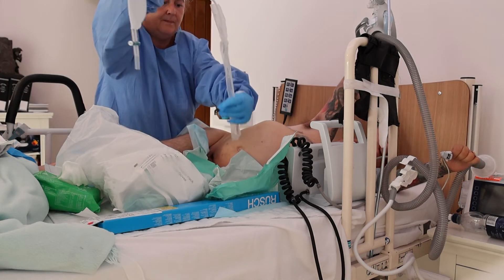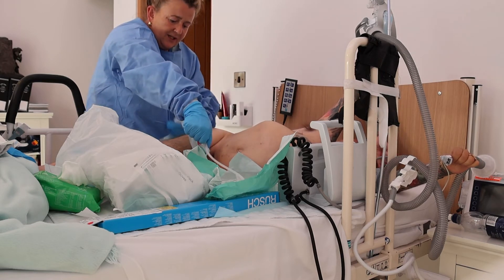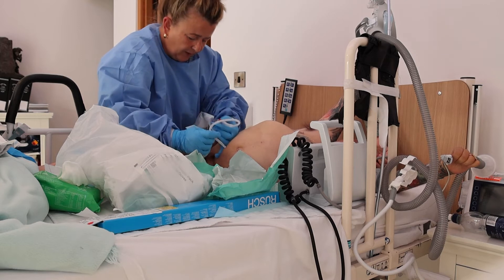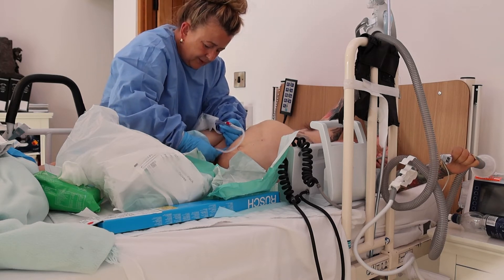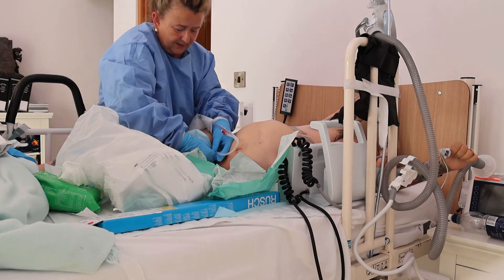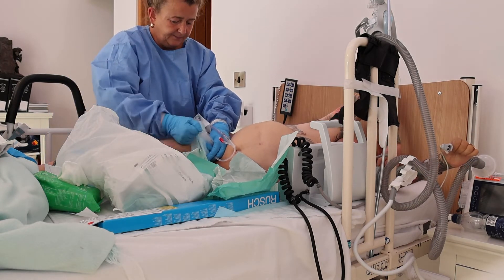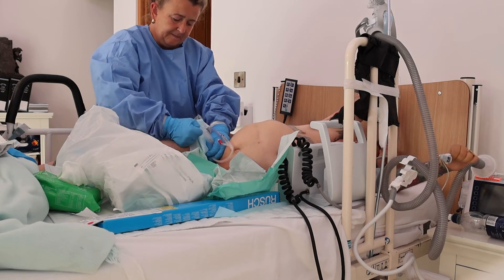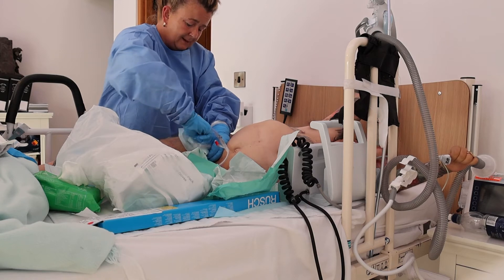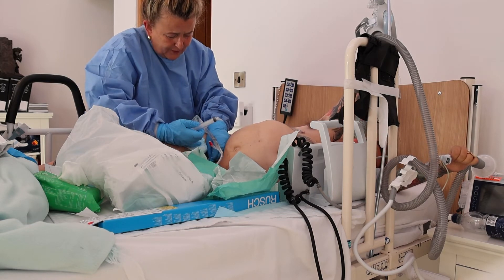I take this out, pop it onto the trolley gently across his body as gently as possible — do not put the catheter anywhere without grabbing the catheter itself. Open up the stoma, in it goes. There's a little tiny resistance — just that tiny bit — and then it sucks in to pop into place. How are you feeling? I've got so many gloves on but I'm holding the catheter in place with one hand. I've already got a load of sediment coming through.